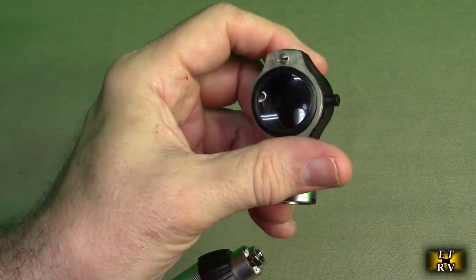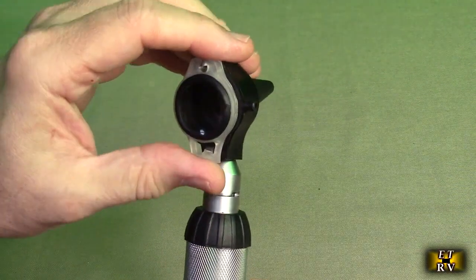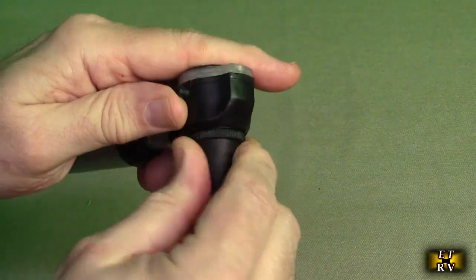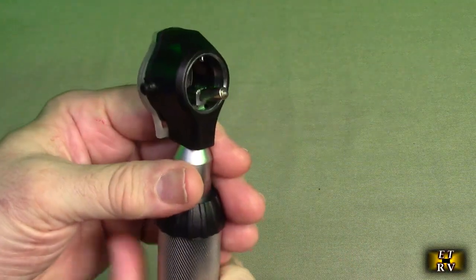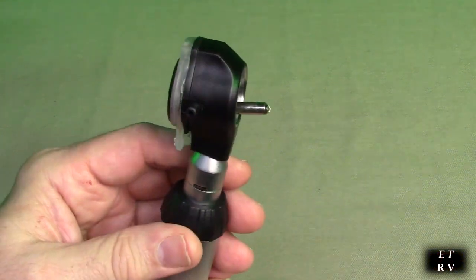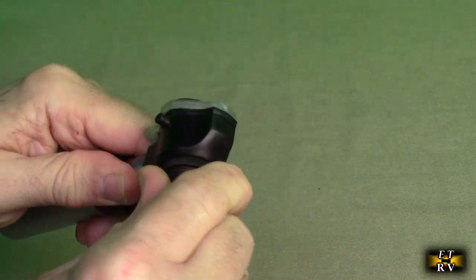Here's the otoscope — it has 3x magnification. You line it up and turn clockwise to attach it. It has a lens you can swing away to see the LED right there, which is the LED that gets replaced. To replace it, you take off the end cap, turn counterclockwise with small pliers, and put the replacement one in. LEDs last a really long time so the odds of that going bad are really slim.